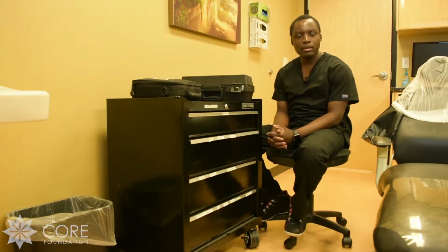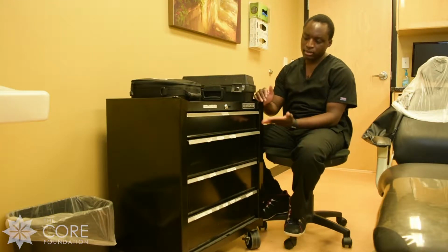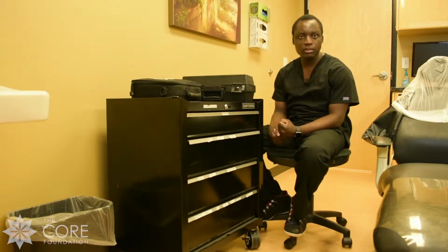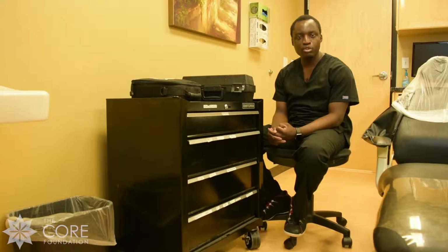I'd like to take some moment to talk to you about this really important thing. It's called a crash cart. It's really important because it has all your emergency medication you need. It has your emergency instruments used to save a life, and also it has emergency procedures on what to do.